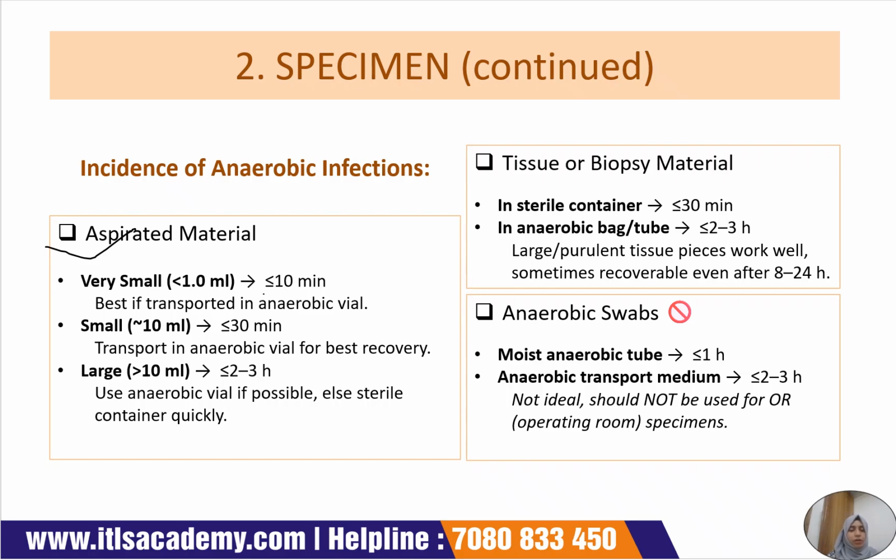For a large volume of specimen, greater than 10 ml, the optimal time must be less than or equal to 2 to 3 hours. The transportation method should involve an anaerobic vial if possible, and otherwise a sterile container. It must be processed quickly.